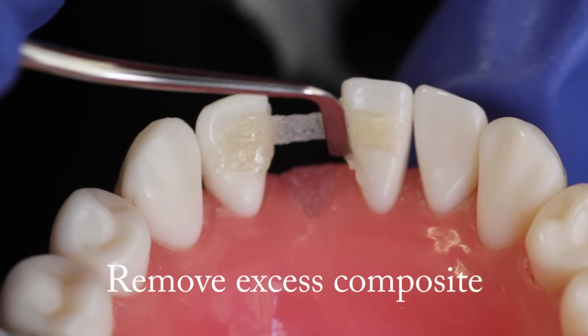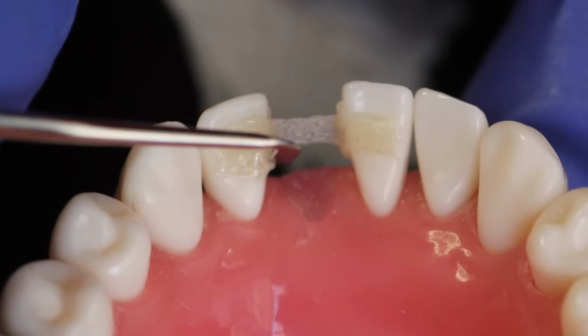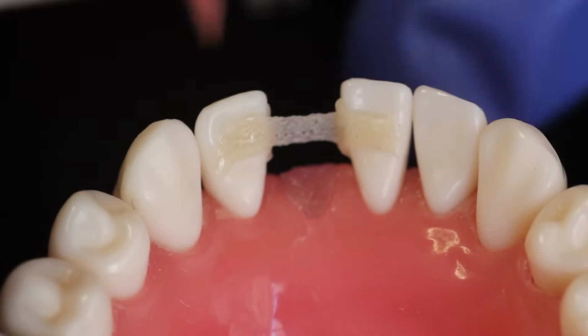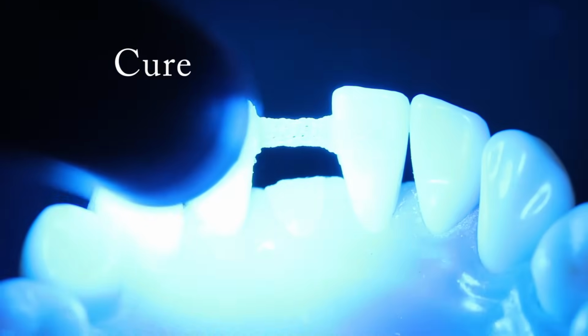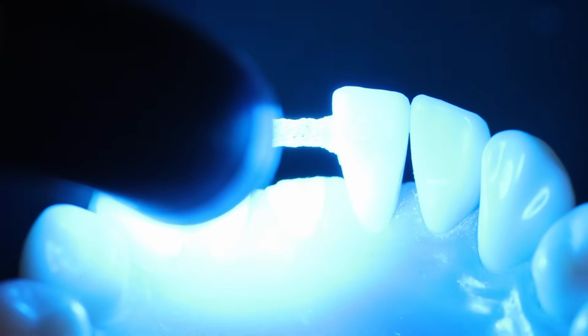After placement, using the same thin-tipped instrument, carefully remove the excess composite resin that was displaced during the adaptation of the ribbon. Move the instrument parallel to the lengthwise orientation of the ribbon to avoid accidentally displacing the ribbon. After the first piece of ribbon is adapted, polymerize the framework according to the composite manufacturer's instructions.